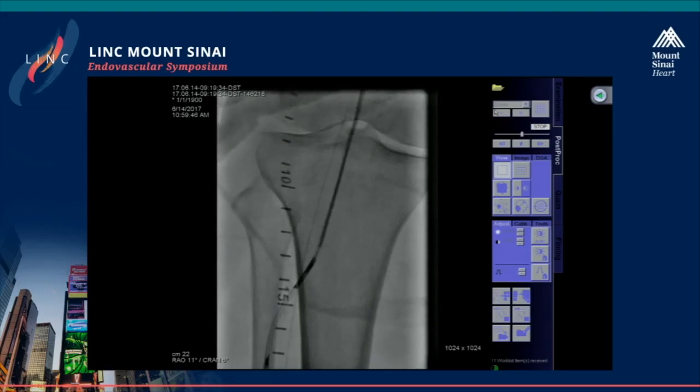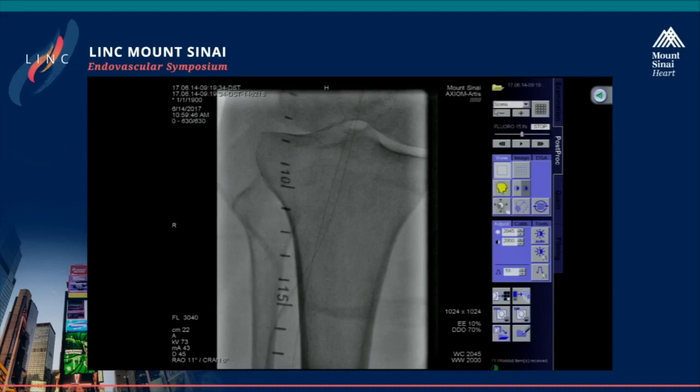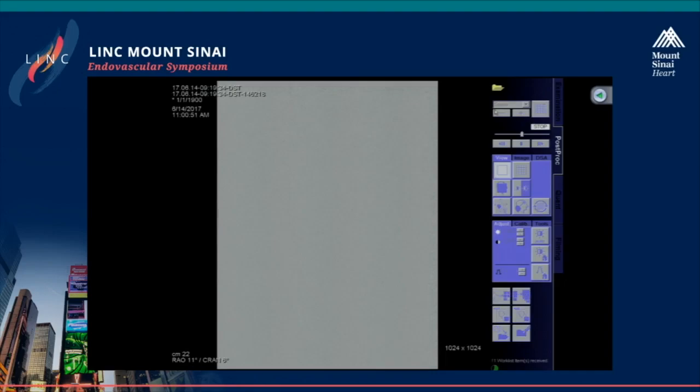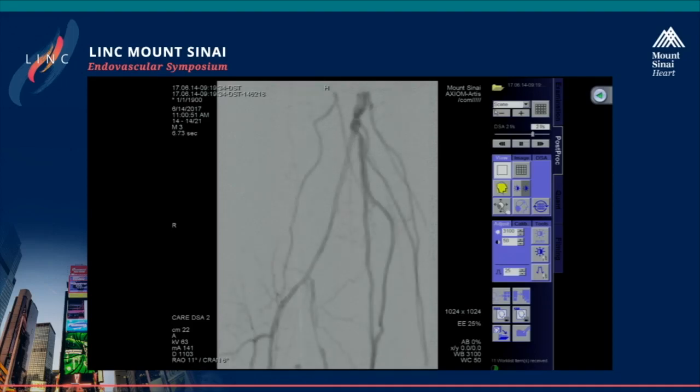The other thing is we also have focal force balloons. If you are a little bit hesitant with atherectomy, there are four currently on the market: Chocolate, Vascutrak, AngioSculpt, and the cutting balloon. If you were trying to modify the plaque to deliver biologic therapy, as Brian and Miguel were saying, that may be a reasonable option as well. And I think your point is well taken with both the laser and focal force. You really don't want to stent down the trifurcation if at all possible. What's the vessel size? You're trying to get a good lumen without dissecting, and then add drug-coated balloon therapy. This is one way to do it.